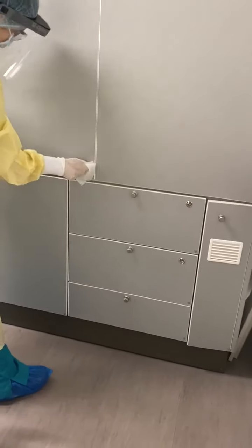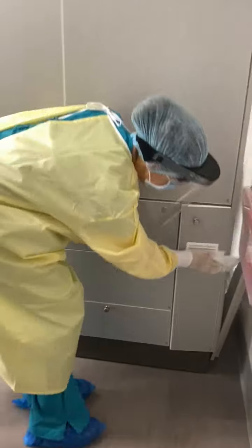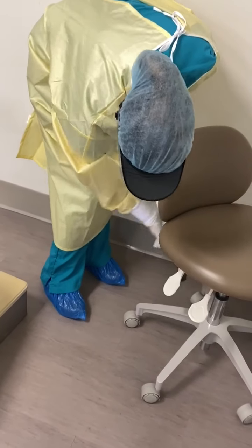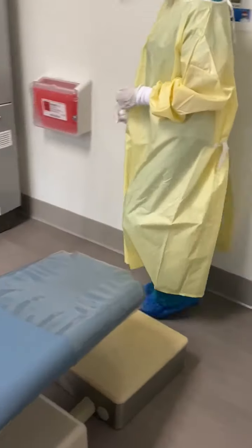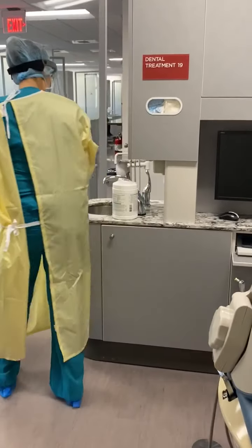And then, lastly, we will do the operator stool. Now, we will wash the leather surfaces with soap and water.